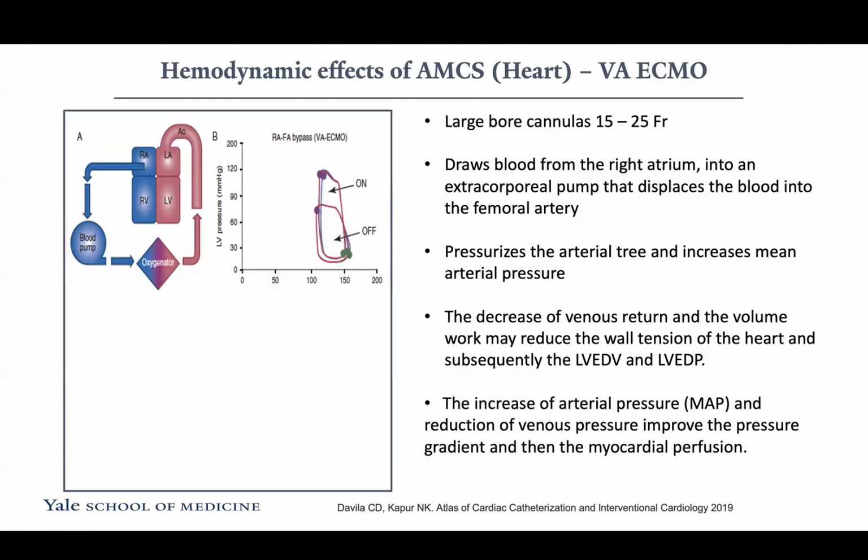Recently at the retreat, we heard that there are a couple of initiatives about increasing ECMO, and how critical care and cardiac surgery are discussing these things. I do think both heart failure and interventional cardiology should be part of those discussions because there is growing evidence about ECMO in the cath lab, its utility, and new cannulas that are designed for interventionalists. So first of all, we need to understand how ECMO works. Can someone walk me through this?